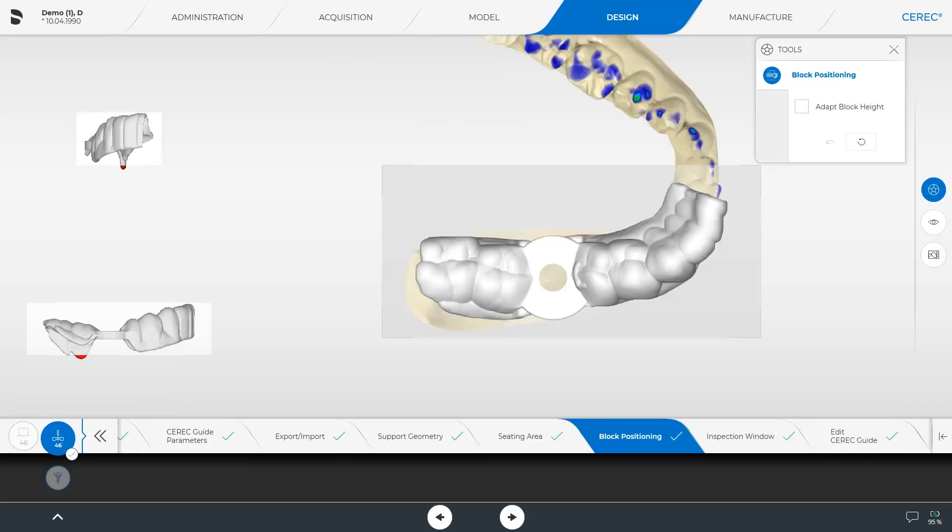Now the guide has been calculated, and the CEREC software automatically positions the surgical guide inside the block. The block size is determined by the milling unit selected in the administration phase. The guide repositioning can be performed in three views.